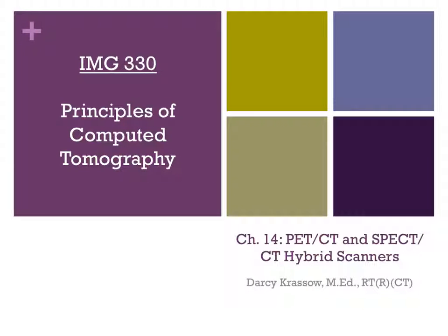Chapter 14, PET CT and SPECT CT hybrid scanners. We know that CT can provide in-depth anatomic detail of a patient that is extremely beneficial to the patient's diagnosis, but what does positron emission tomography, or PET, and single photon emission computed tomography, SPECT, provide? They actually provide functional information regarding the patient.